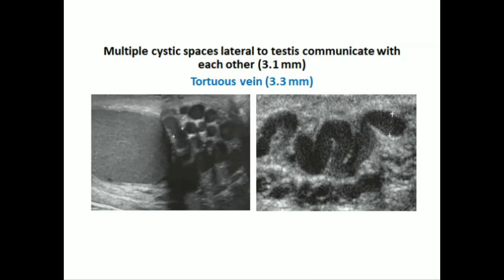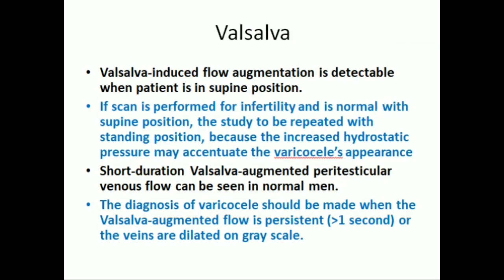This is a typical image of varicocele. Valsalva-induced flow augmentation is detectable when the patient is in the supine position. If the scan is performed for infertility and is normal in the supine position, the study should be repeated with the patient standing, because the increased hydrostatic pressure may accentuate the varicocele's appearance.